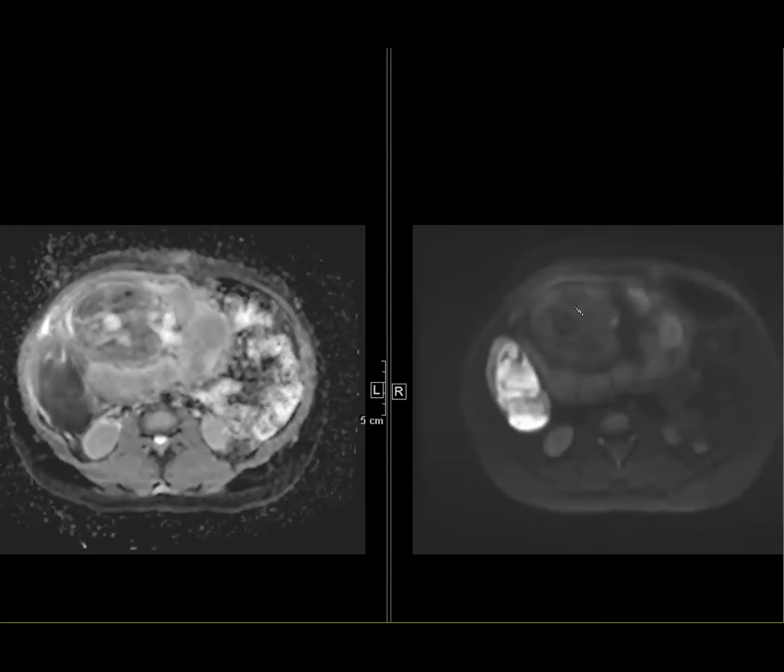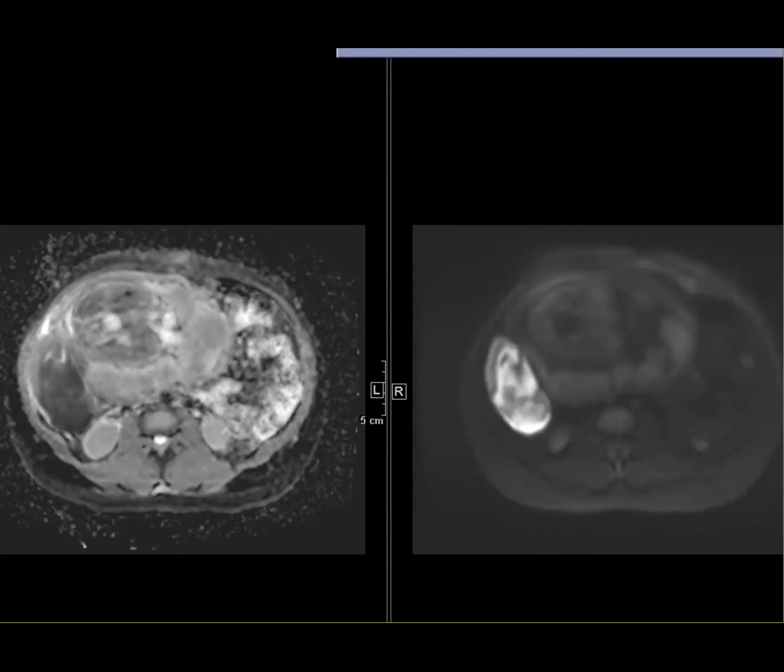So that hemorrhagic cyst was the lead point for the torsion. Yes, Aarti, that was my case, and I followed up the OR report. It's interesting. We thought that it was hemorrhagic infarction. Also, I think there may have been an ultrasound for this case as well before the MR that didn't show a cyst. So it's interesting that they found this.